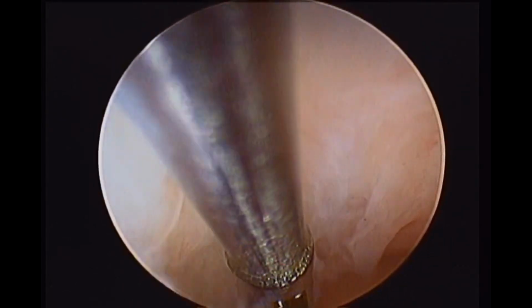After clearing the way, then I use the grasper to remove some of these shreds and enjoy the final view.